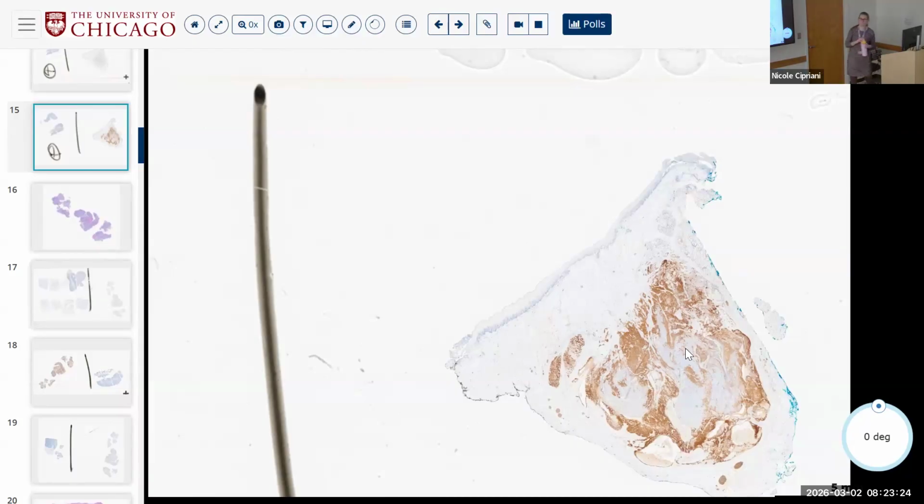Do we have to worry about a mesenchymal process in mucosal tissue when you see this pathology? I mean, not just rhabdoid looking, but also... Yeah. If you see something that's hyaline plasmacytoid in a mucosal site, I'm not super thinking a rhabdo, because it's pretty bland.